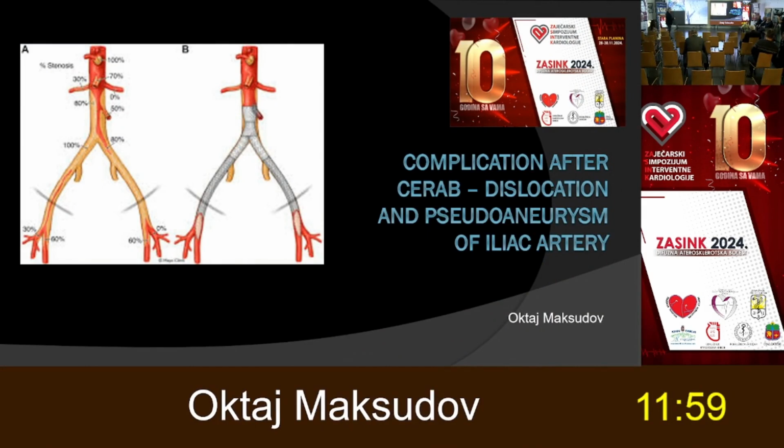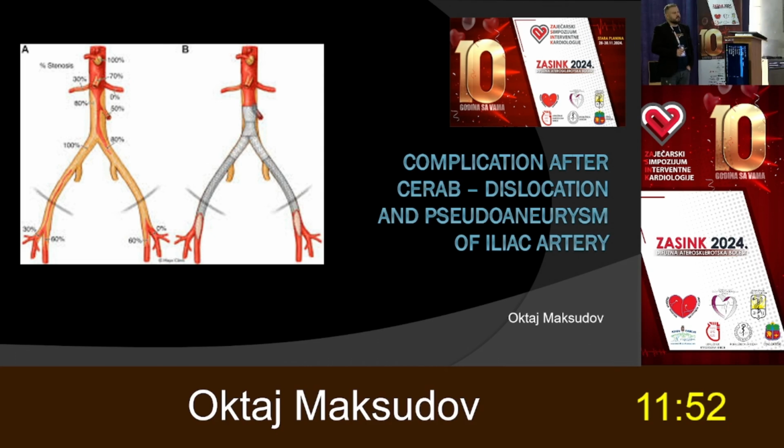So, dear colleagues, this is a case of a complication, a complex case after Cerab. This technique of covered endovascular reconstruction of aortic bifurcation, which is done at Leriche syndrome, and one of the complications is dislocation and pseudoaneurysm of the iliac artery.